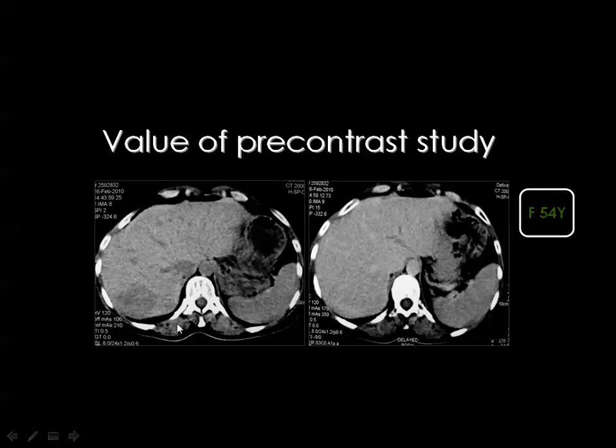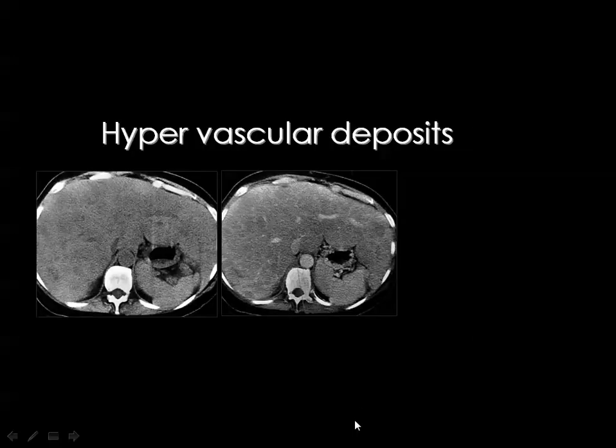Sometimes, in some lesions, the lesion takes the contrast media similarly to the liver parenchyma. Then if you started the examination with contrast injection and didn't have the pre-contrast scan, you have the chance to miss one or two of the focal lesions, which are in many cases usually seen by ultrasound, of course, because of the different physical principle of ultrasound and the CT scan.